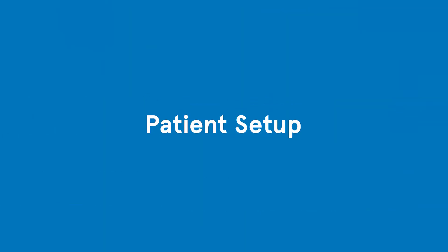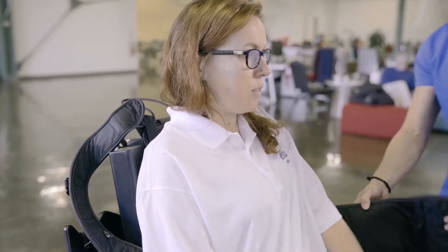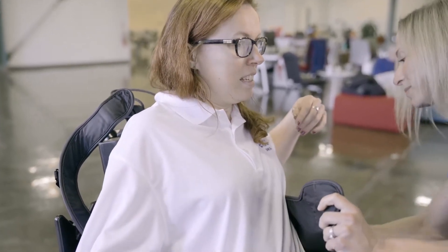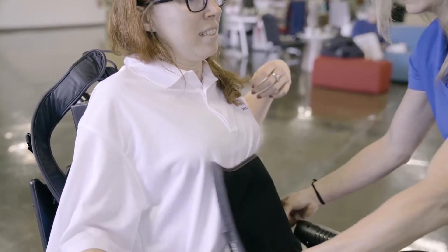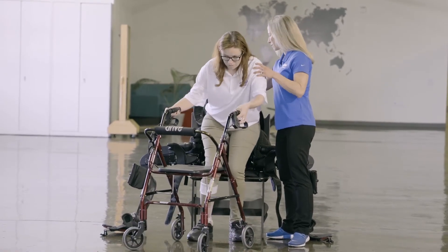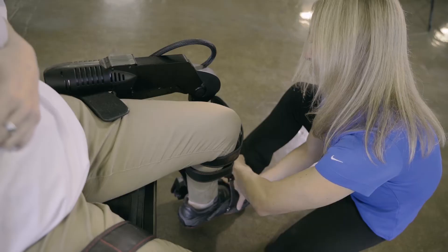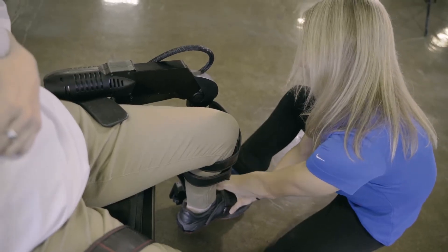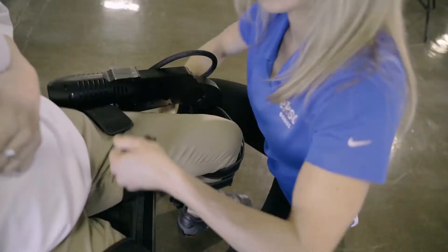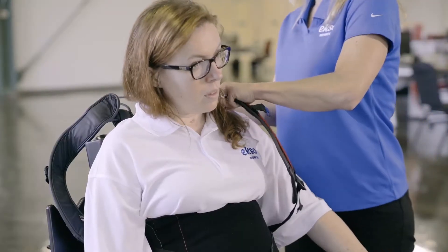Patient setup: donning the device should take approximately five minutes and involves choosing the appropriate fit kit items to make sure XO will fit the patient comfortably and accurately. Putting XO on involves having the patient transfer to a chair that XO is sitting in and wrapping the XO around the patient. There is a foot binding, a tibial brace, a thigh brace, a torso pad, and backpack straps to unite the XO and the patient.